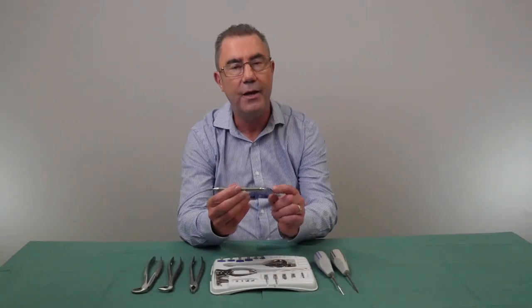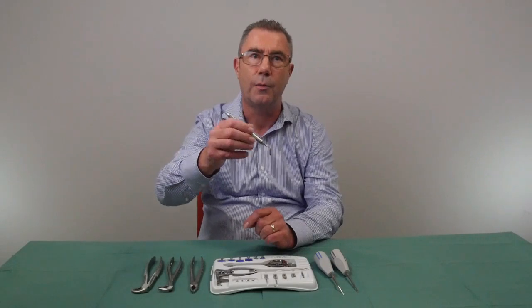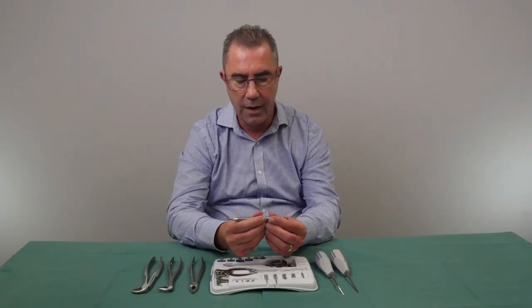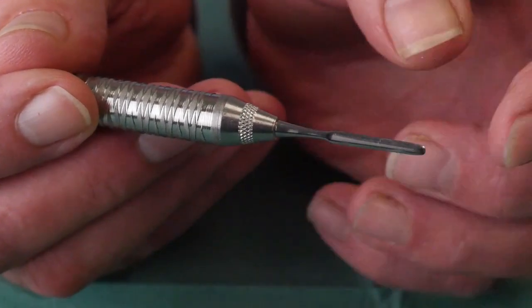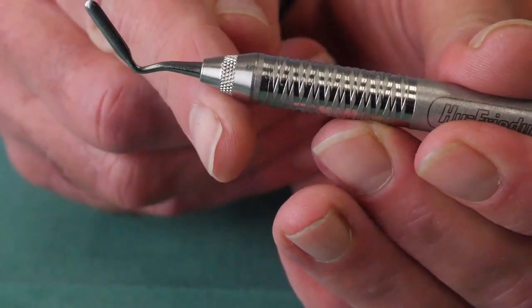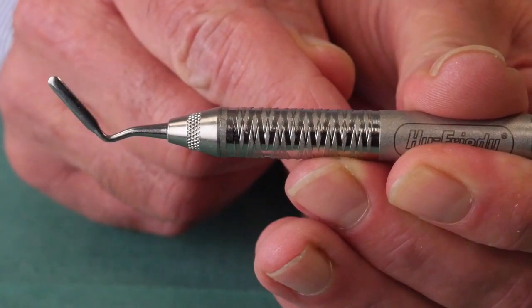Peritomes are essentially a very thin blade used to cut down around the periodontal ligament to loosen the root. You can get them in a variety of shapes — most are either straight or angled. The angled ones enable you to get access towards the posterior region of the mouth.